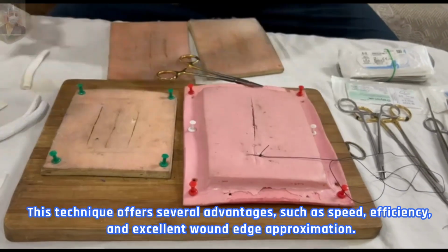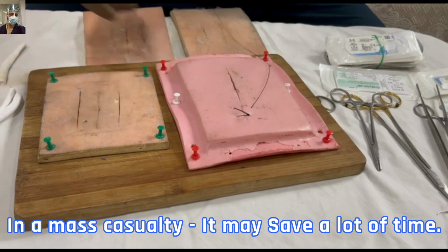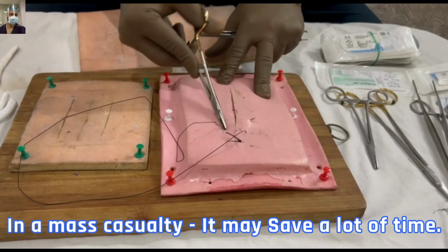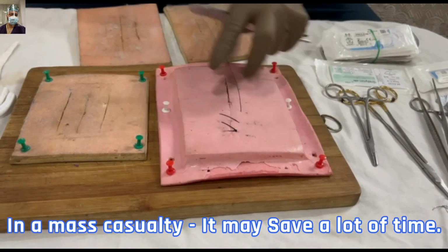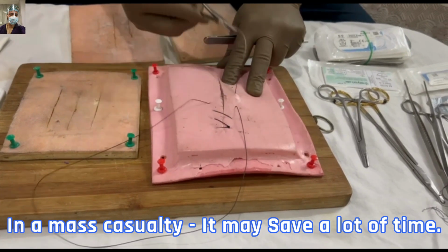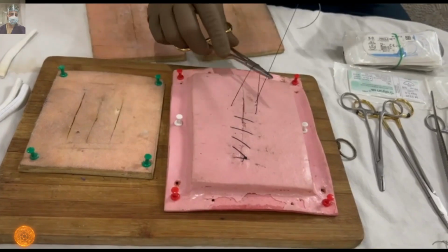So the entry and exit points are at the same point, and in a similar way, we keep progressing. How to enter the wound at exactly the right angle, how to follow the curve of the needle, we have already talked about in the previous two videos. So I'll skip that part, and this is how we will keep progressing. This is again a very good technique, though it is followed less, but it is a must-have in the armamentarium of all budding surgeons. So we keep progressing, getting good apposition and saving time, and at the last suture we apply the knot.